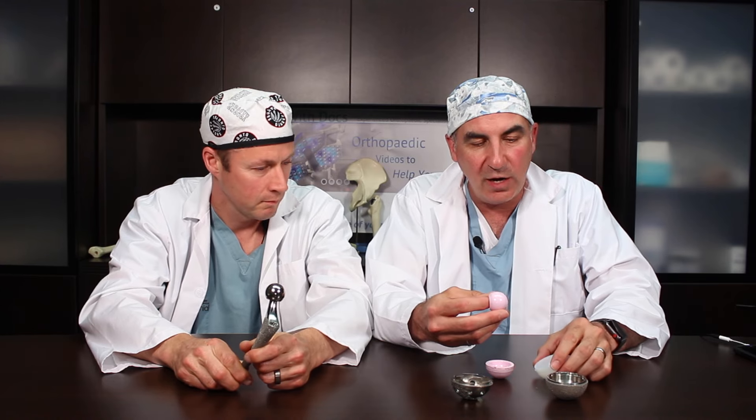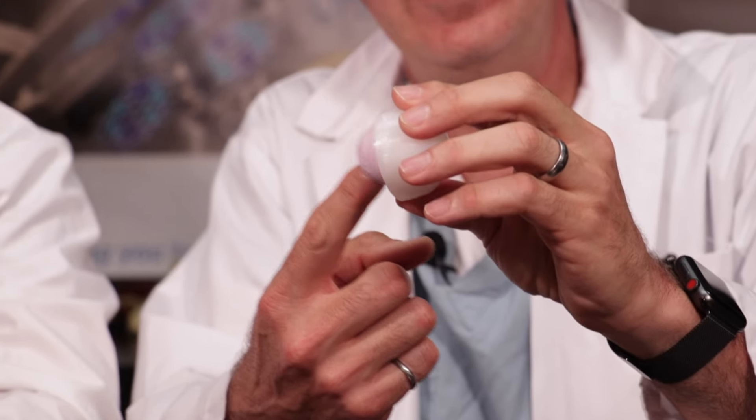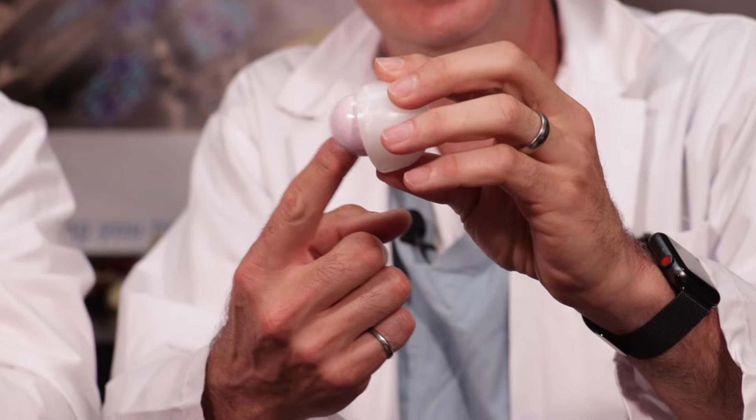The ball, or femoral head, is typically made of cobalt chrome. Titanium is not ideal as a bearing surface itself. You can also have a ceramic femoral head, which can articulate with either a ceramic cup or a plastic cup. Femoral heads are not all the same size — sometimes we use larger or smaller femoral heads depending on the anatomy. The advantage of a larger femoral head is that it's harder to dislocate. For the head to dislocate, it has to travel half the diameter before it can jump out, so a larger head has to travel farther, making it more stable and less likely to dislocate.